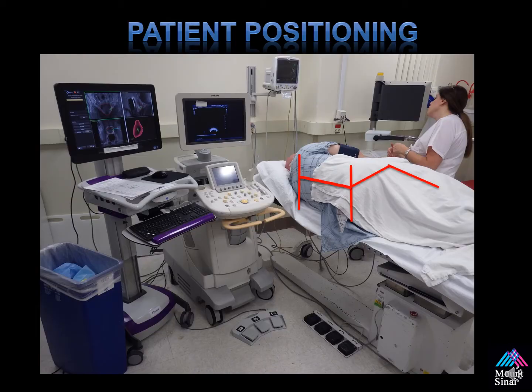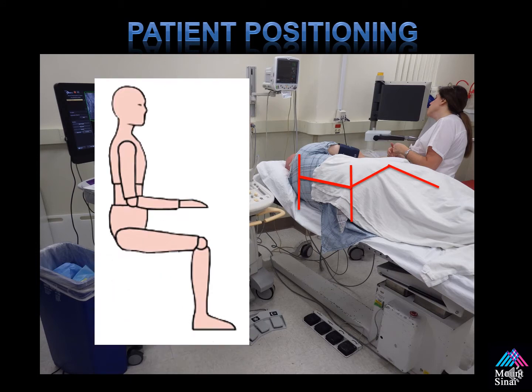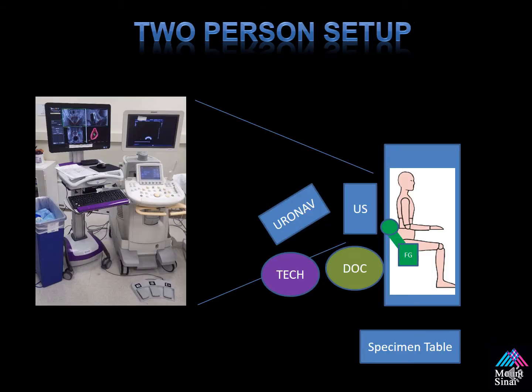This is a two-person setup. What's important here is the patient positioning. A patient should be positioned in the left lateral decubitus position with his hips and knees bent at 90 degrees. This allows you to keep the hips square for easy fusion and optimizes your sweep. The field generator is positioned over their hip. The ultrasound machine is within reach for the physician to perform his diagnostic prostate ultrasound. The tech stands to his left, controls the Uronav device, does corrections, and helps you through the procedure. And our specimen table is at the base of the bed.